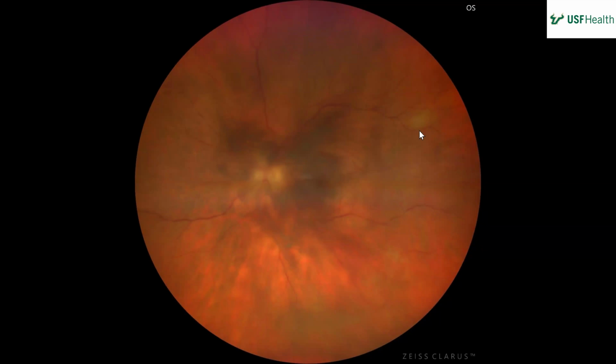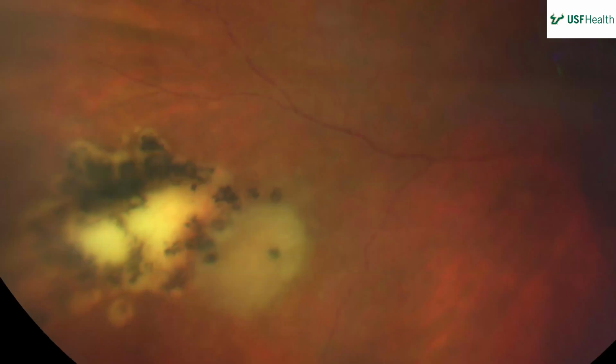The view's not great, so it might be just a shadow, but it might be something, especially if there's this little granular area down in her temple. Yeah, there might be a little spot over here. Maybe, if I blur my vision a little bit, I could say that. Yeah, I'm squinting. I can't get much out of this just with the blurred view. And we're going to get a magnified view.